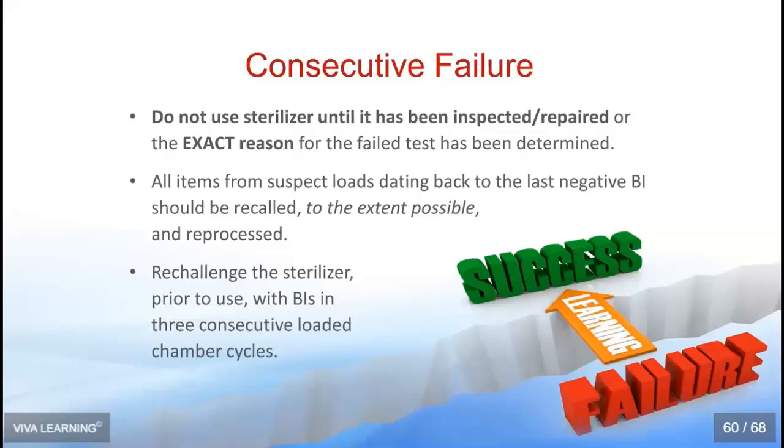We're not in a total panic situation. However, what you can recall should be recalled. They should be repackaged and reprocessed. And obviously, you're going to recall them based on the date that's written on each of your pouches or packages.